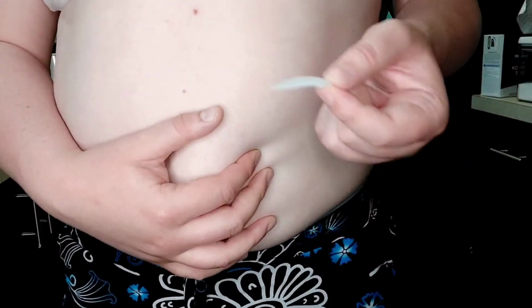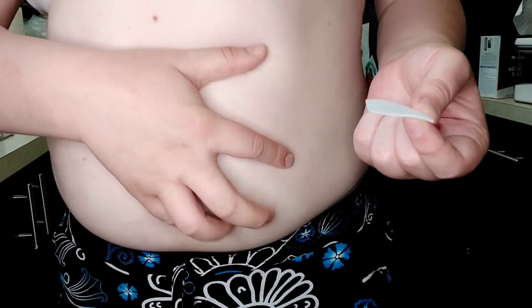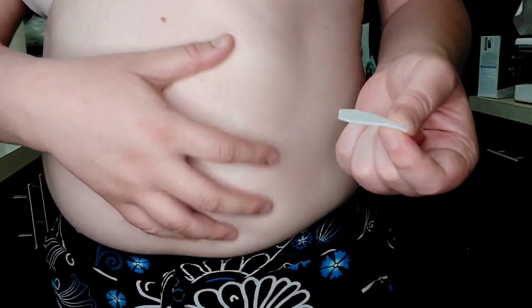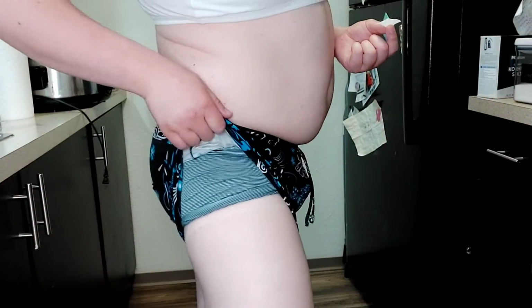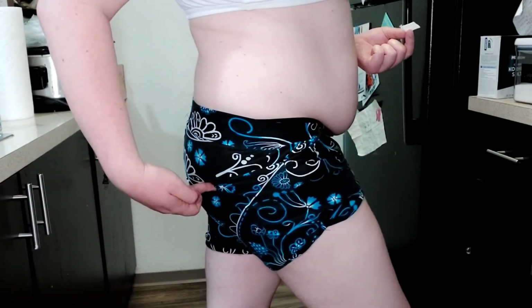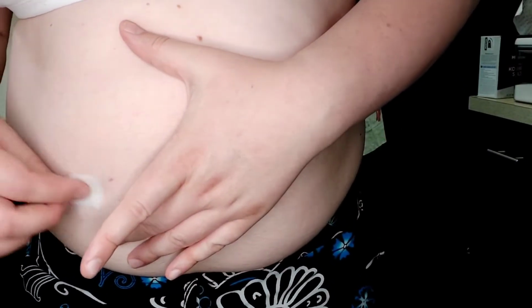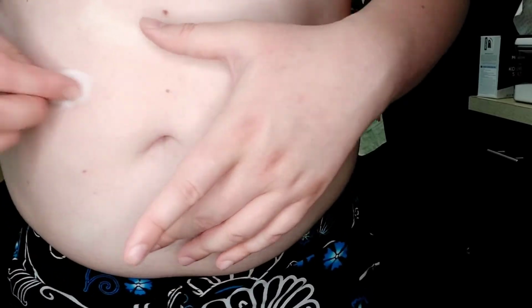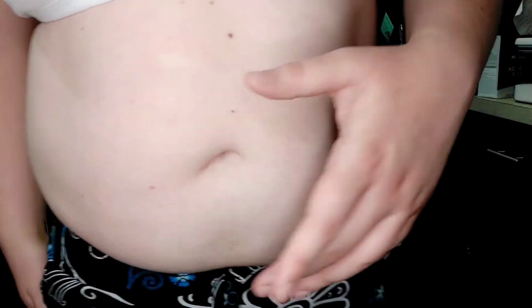For me, I am going with a subcutaneous injection into the subcutaneous fat in my belly here. You can see I have a lot of fat. It's a nice place to inject. A lot of doctors will also have you go intramuscularly into the side of the thigh or into the gluteus maximus. But like I said, I go subcutaneous. I injected over here last time. So this week I'm going to inject on this side. Just going to go ahead and get this all nice and sterilized.